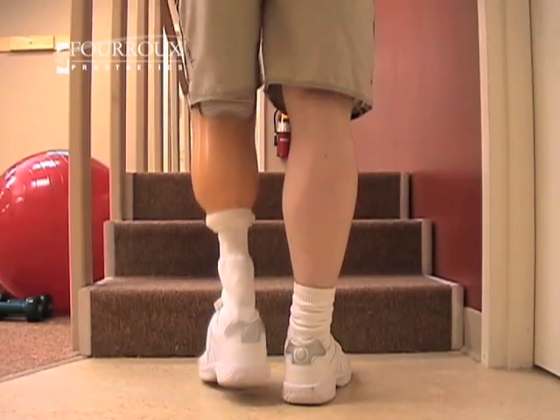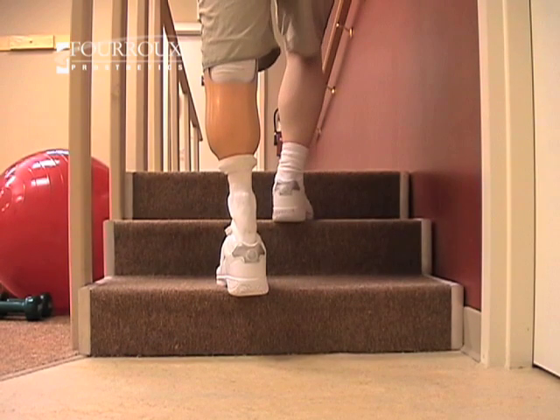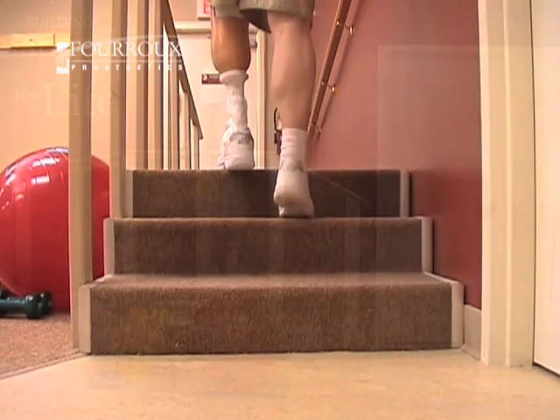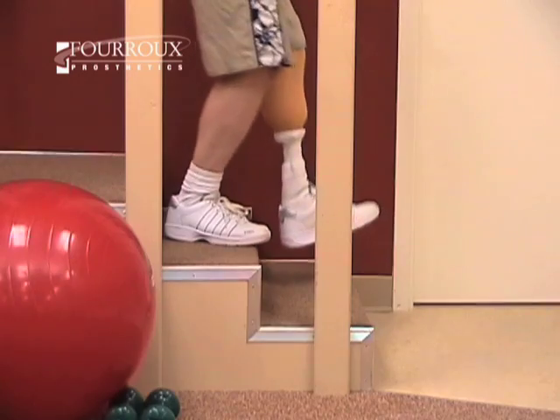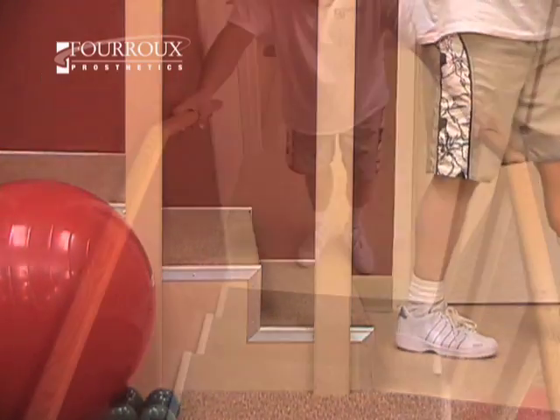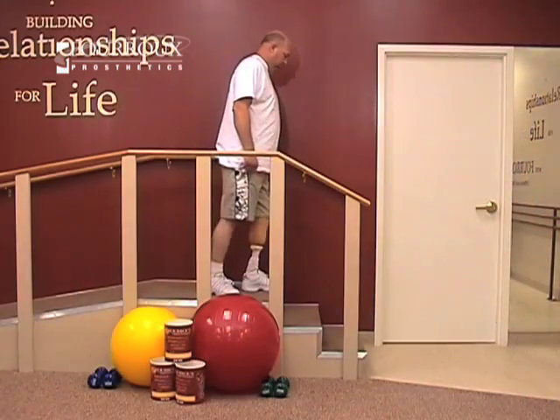Once your prosthetic leg is safely planted on a step, bring your sound limb up past your prosthesis and place it on the next step. To walk down a stairway, start with your sound leg. Remember, always have control of your prosthesis before moving your other limb. Practice using the handrails at first, but work toward walking stairs without them.